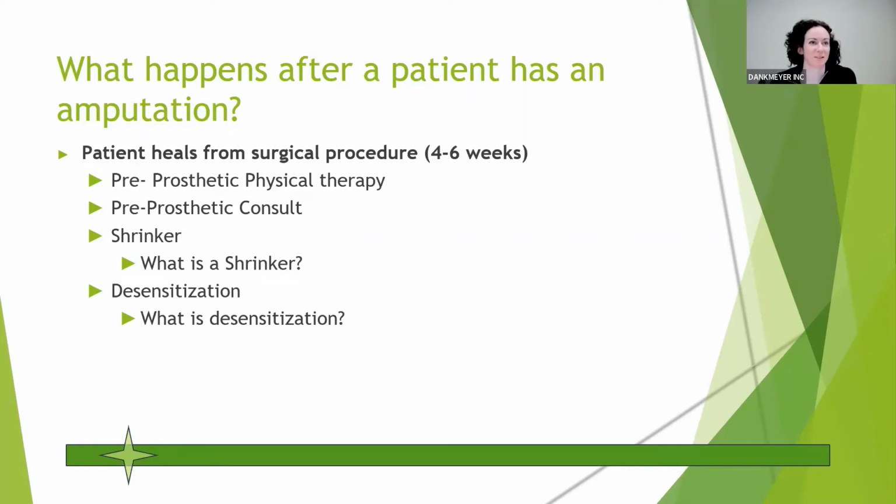It seems to go in waves a little bit. And it really depends on the physician and what their comfort level is. There are a bunch of physicians who do like to put someone in a rigid removable dressing as soon as possible, even before the sutures or the staples are removed. That does give some nice protection.